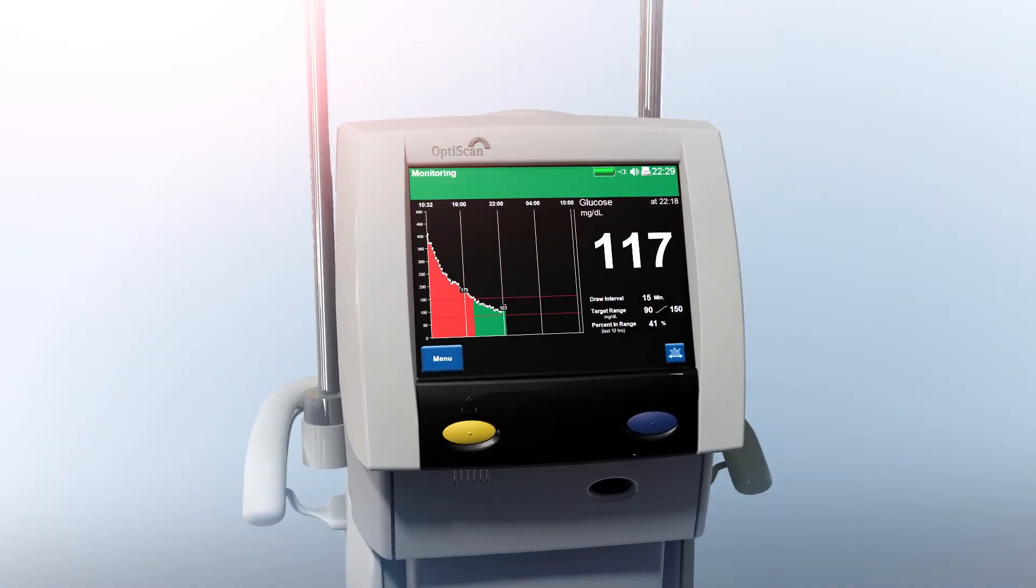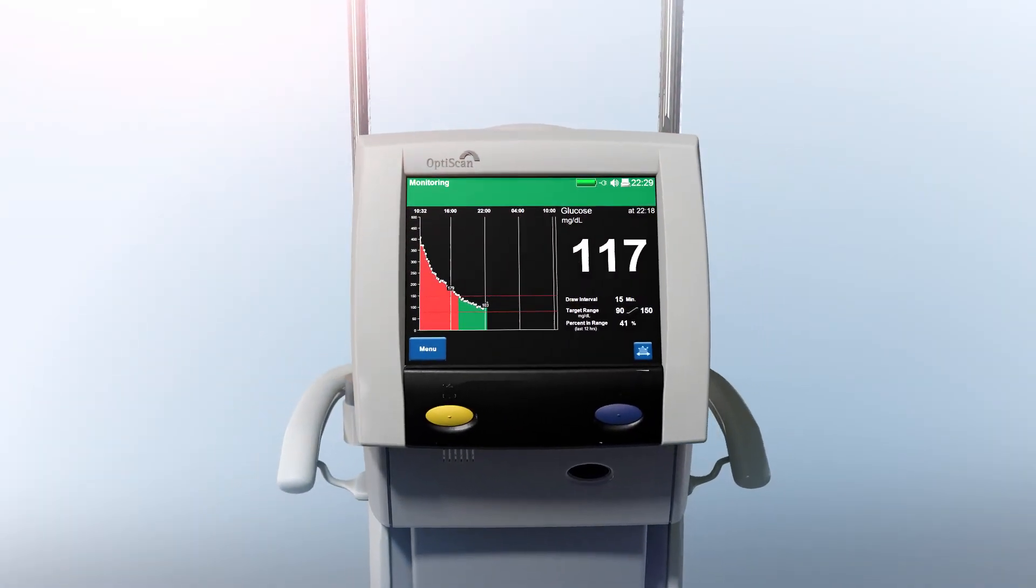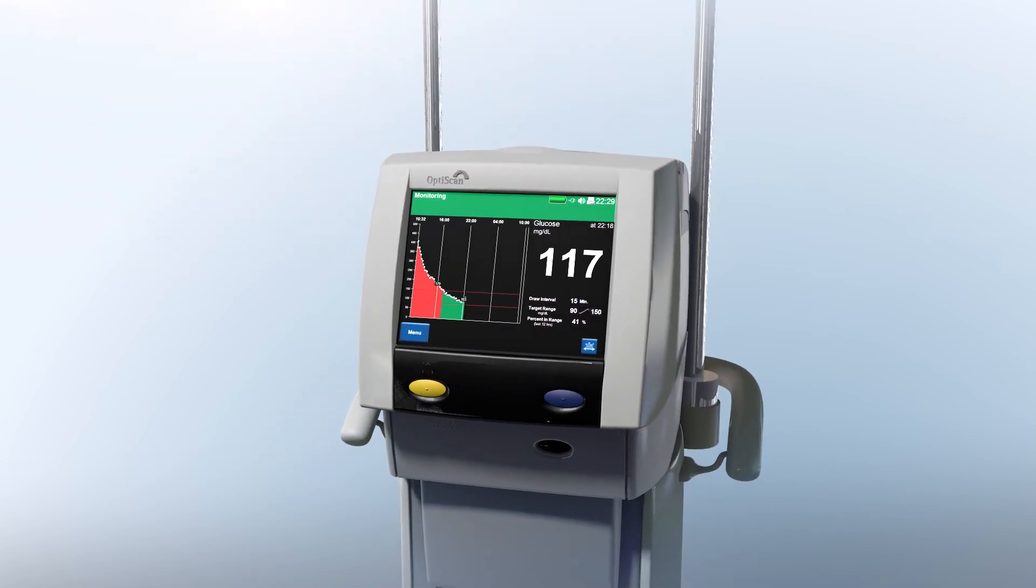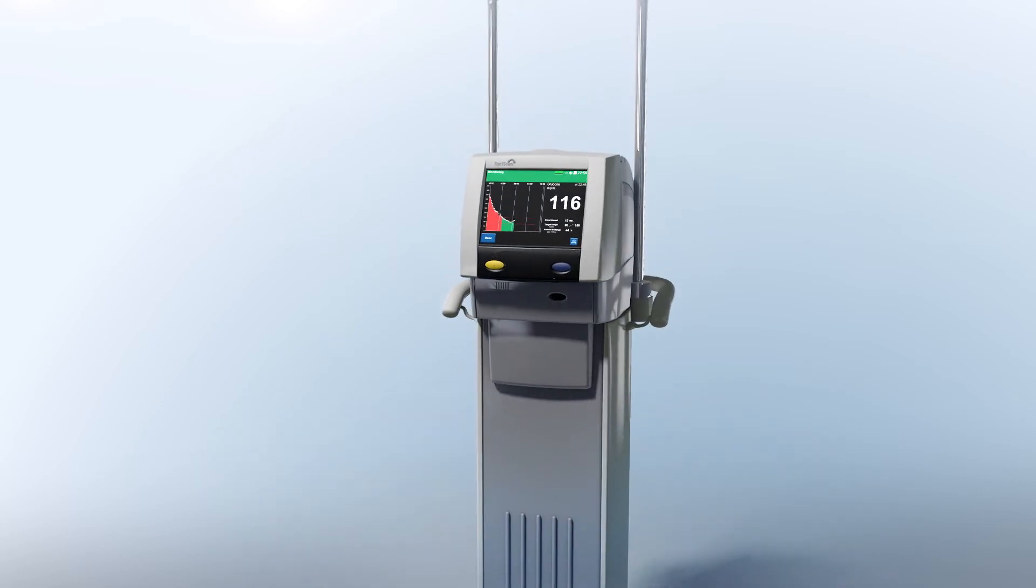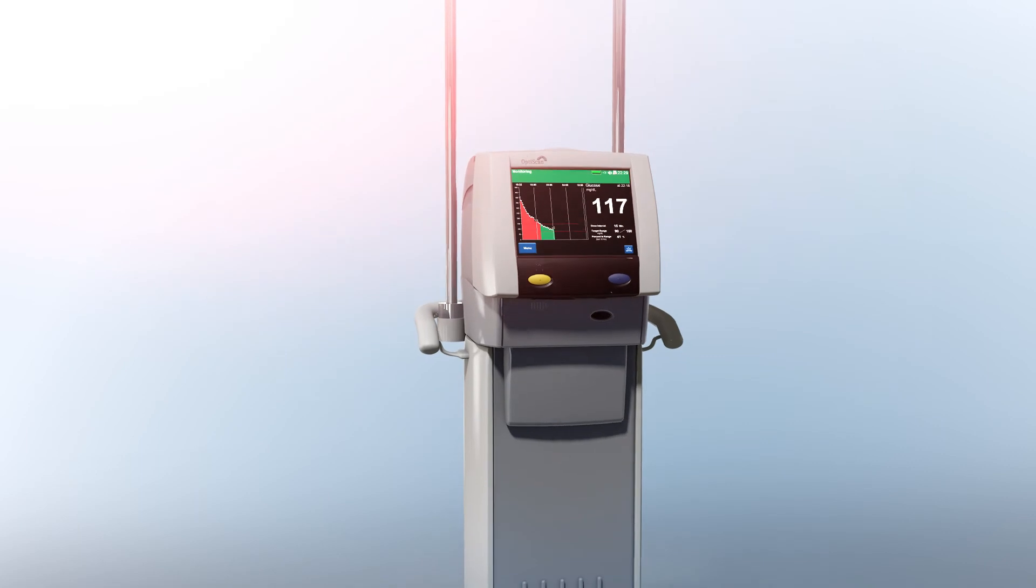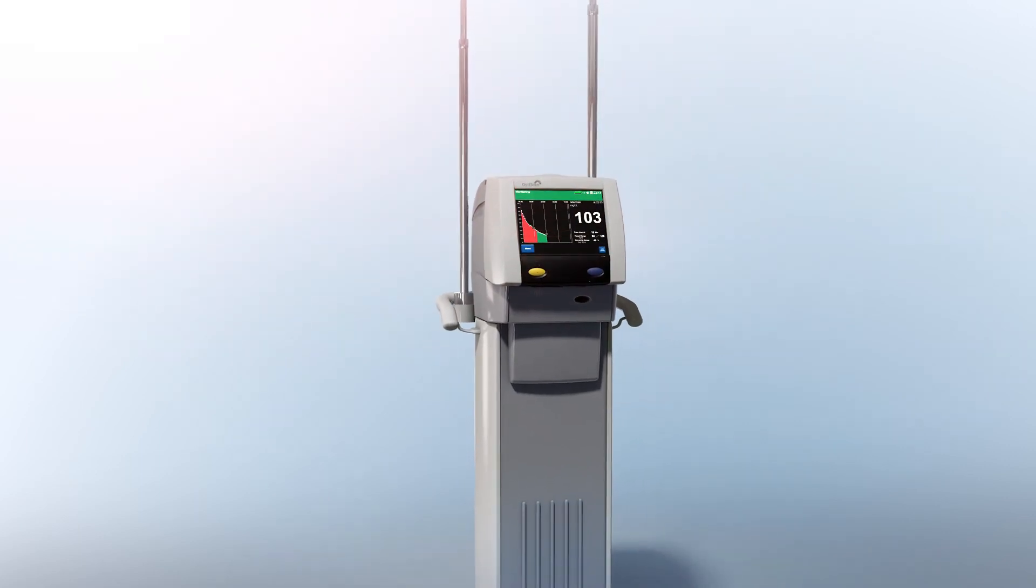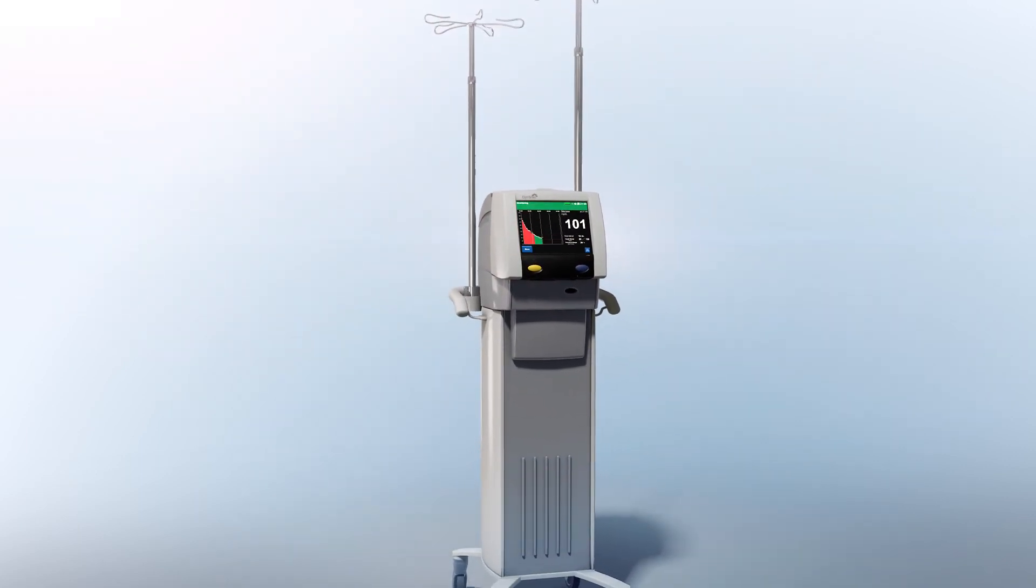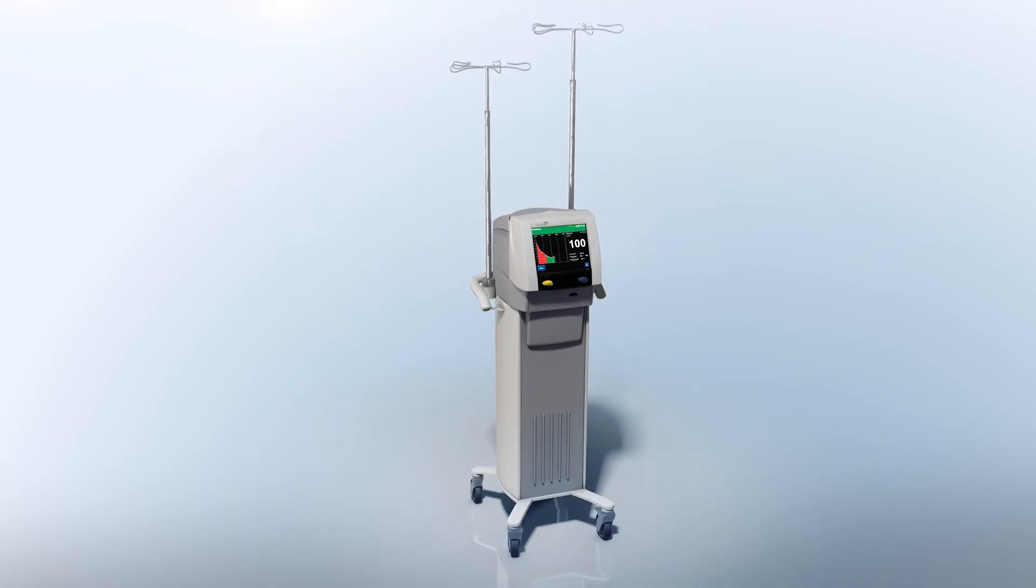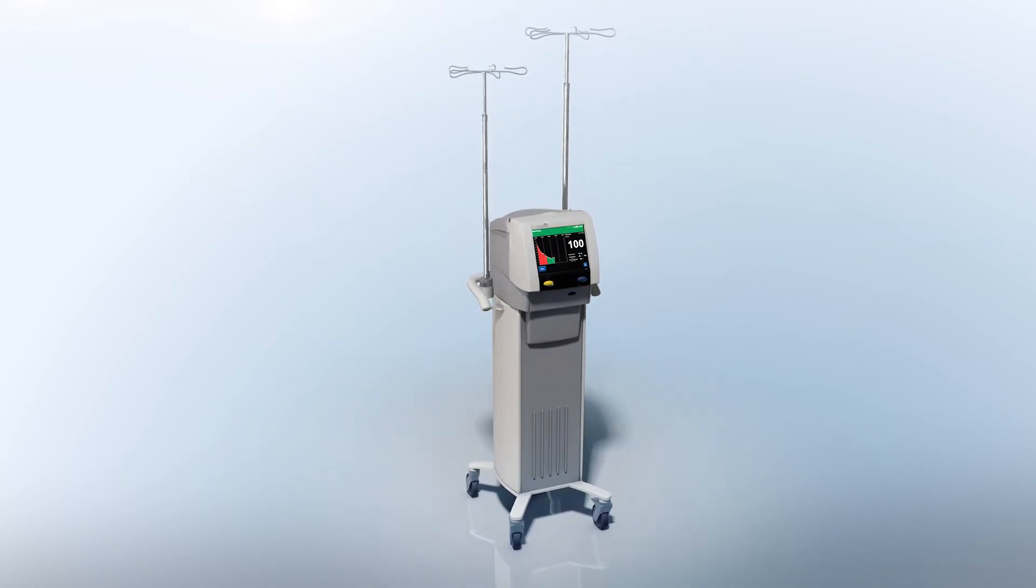The OptiScanner 5000 is a first-of-its-kind bedside blood monitoring system that provides automated monitoring of patients' glucose levels to help clinicians maintain desired levels of glucose control. It represents the first step in the development of an automated bedside blood monitoring platform that will deliver valuable metabolic and hemodynamic trending information for critically ill patients.